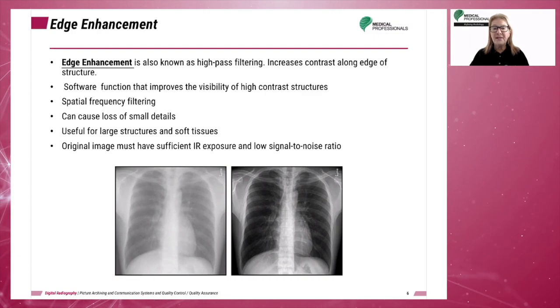When the frequencies of the region of interest are known, those frequencies can be amplified and other frequencies can be suppressed. This process produces an image with increased contrast.